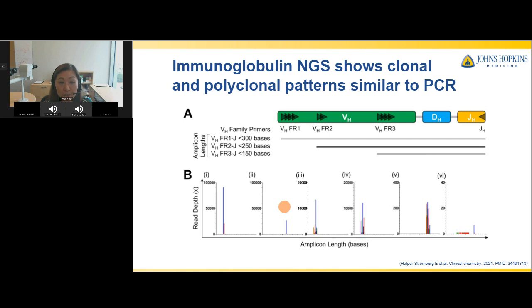The third is a clear clonal monoallelic where there is actually polyclonal background signal, whereas the previous is in the absence of polyclonal background. The fourth example is what we call an indeterminate for clonality category, where the signal is not strong enough to be definitively clonal. This fifth one is a polyclonal pattern, and the last one, as you can see from the y-axis, is actually what we call a pseudoclonal example, likely due to very, very low input DNA, where it appears to be clonal, but this VJ gene does not reproduce in a replicate reaction.